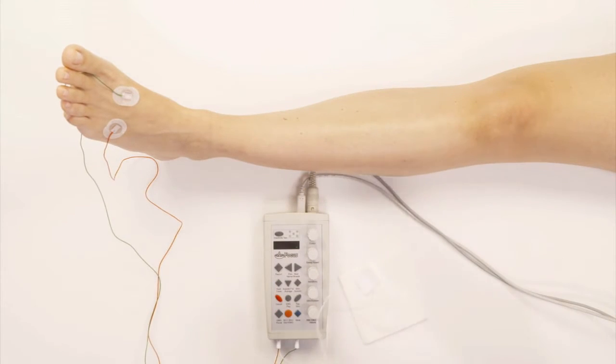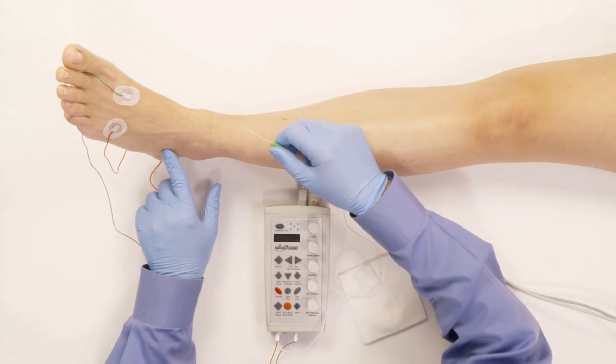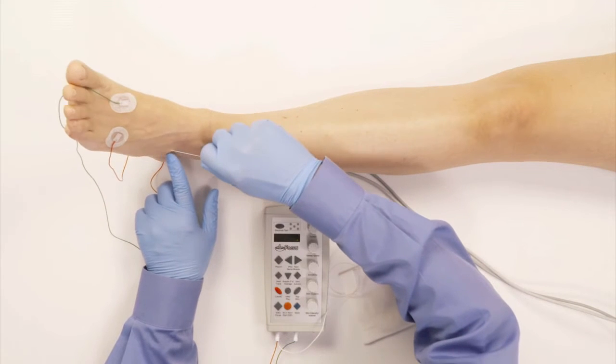So here we go. Again, the needle is plugged in in the black, that means active electrode spot. Bring your foot, your toes up. Here we go. Now relax your toes.